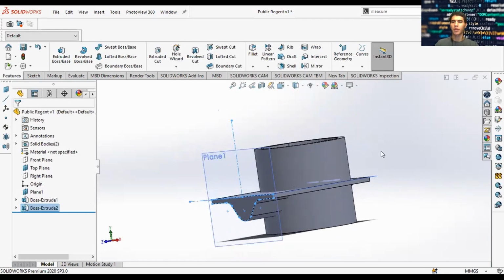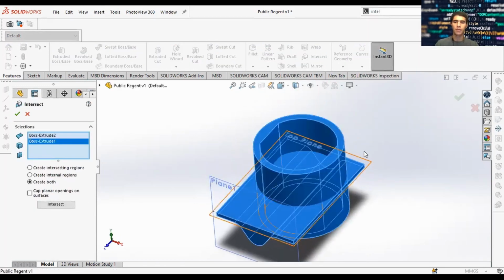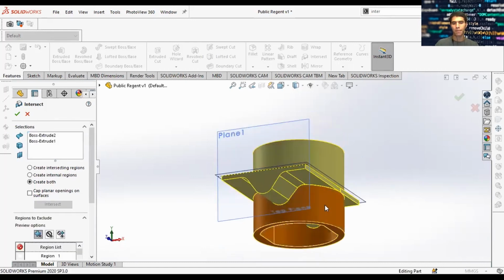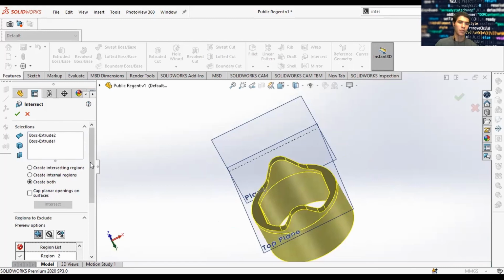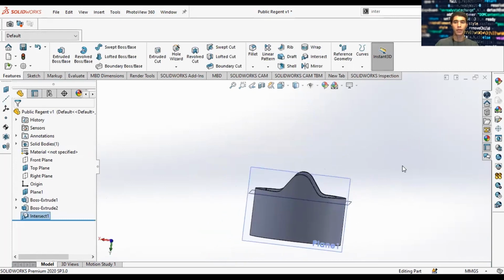Now you have these intersecting bodies. What you're going to do now, click S on your keyboard and do intersect. And you can intersect these bodies, these two bodies. The reason why you need to do two bodies is because you cannot create an intersection of just one body. So that's why you don't do merge features on the previous function. And then once that's good, you can click, and this will give you your final body.